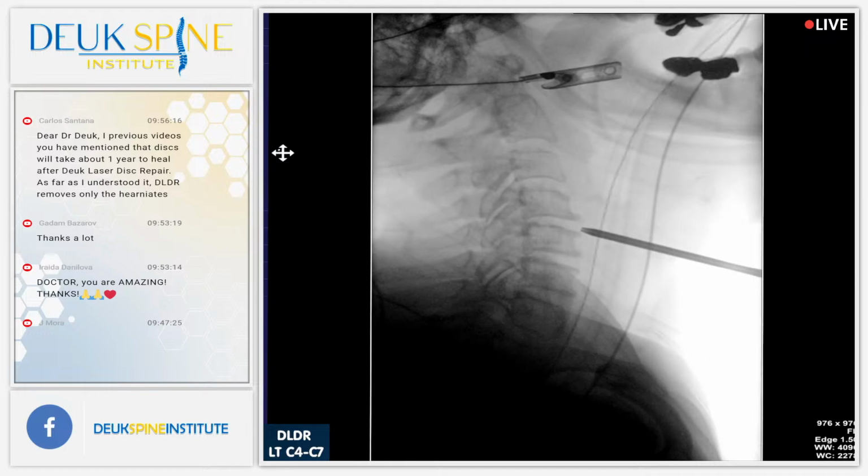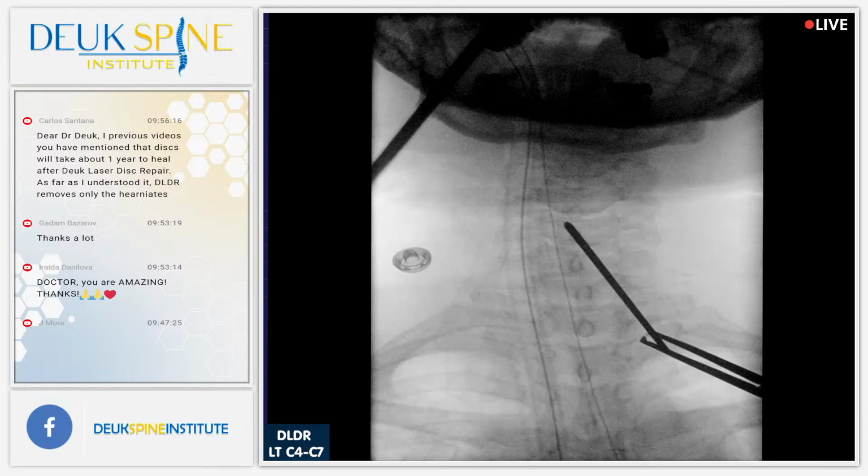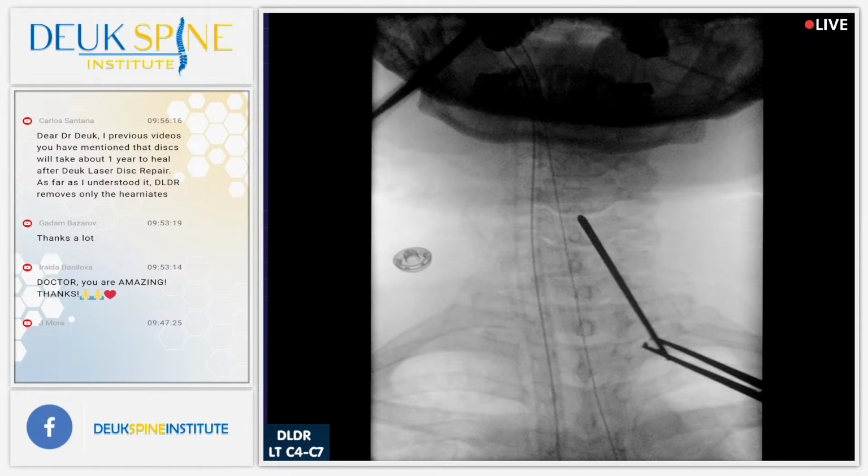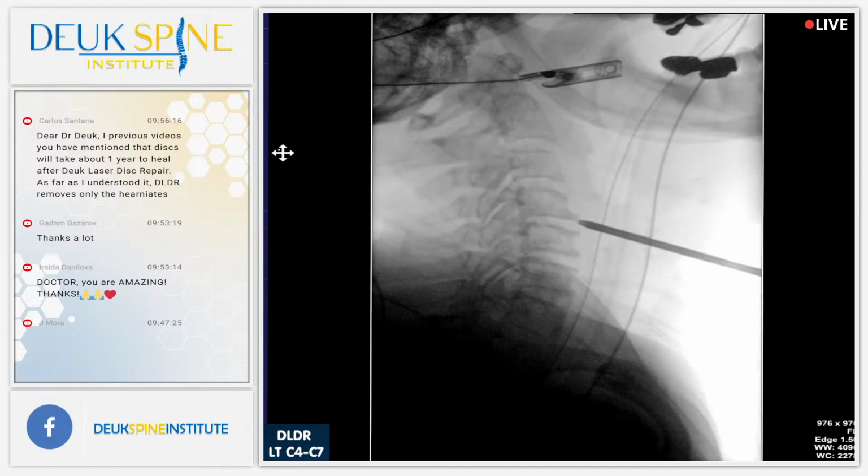Now notice I can do all that just by feeling it. I can feel the tip. That's what neurosurgeons do. We feel our instruments. After years of doing neurosurgery, you can actually use your instrument like an extension of your finger. And the good surgeons can feel everything that they're touching through an instrument. It's really fine motions, you know, changes in texture, surface, elevation, and all that's done through feel. Okay, we are in front of number 4-5.